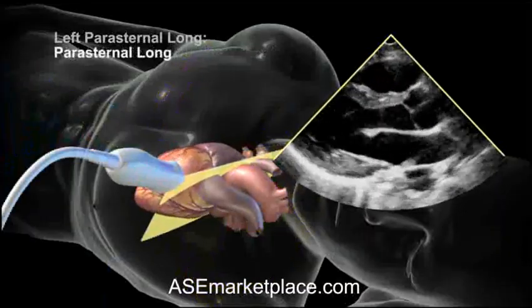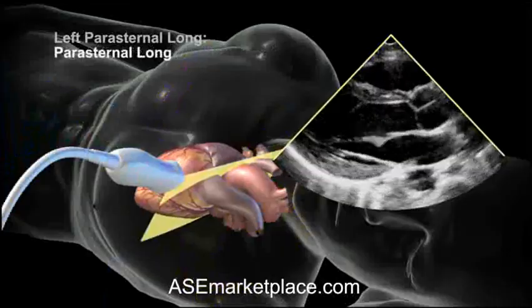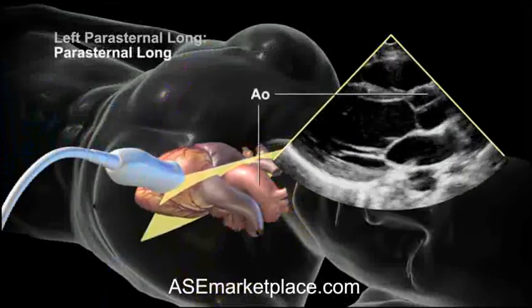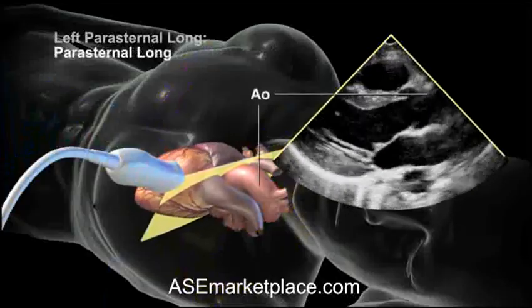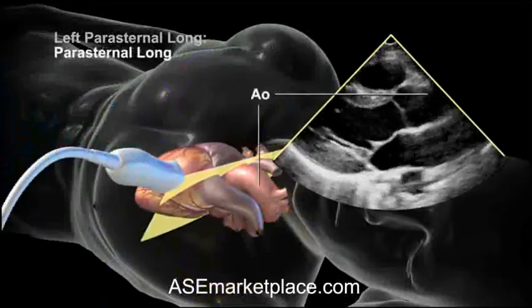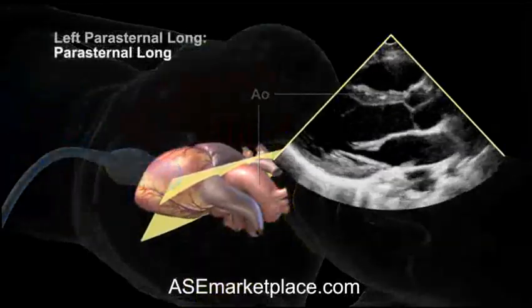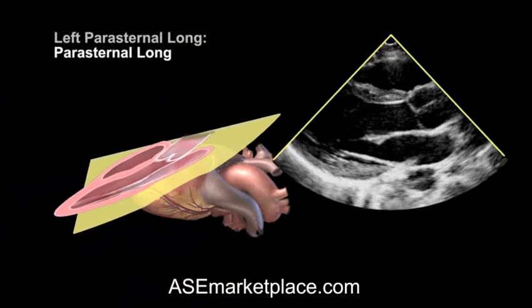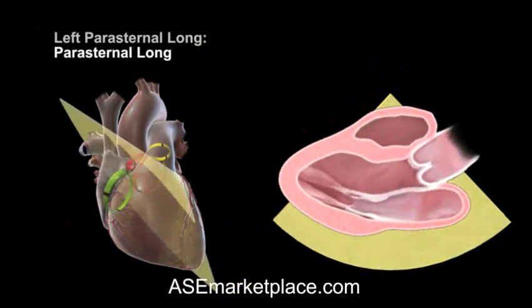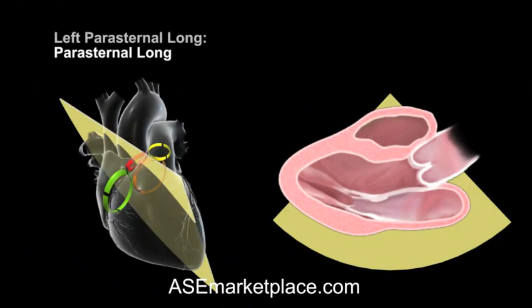Now we will look at each view to demonstrate the anatomic structures visualized. Notice that in this parasternal long axis view, the aorta is labeled in both the animated heart and the clinical image. On the left image, we can see how the parasternal long plane cuts the aortic valve, labeled AOV, and the mitral valve, labeled MV.